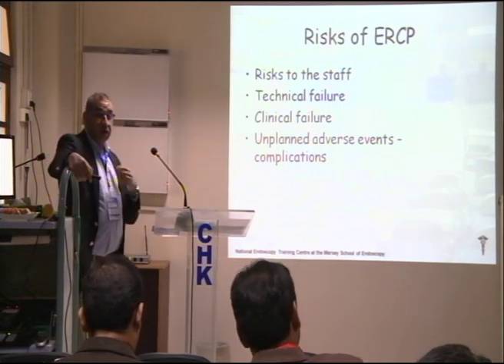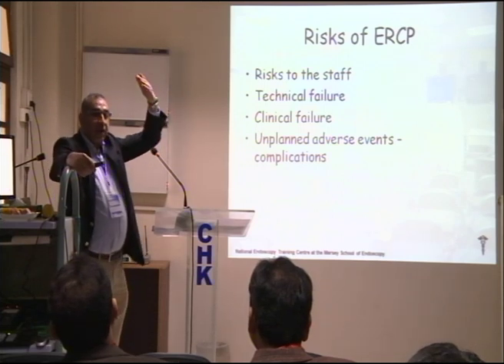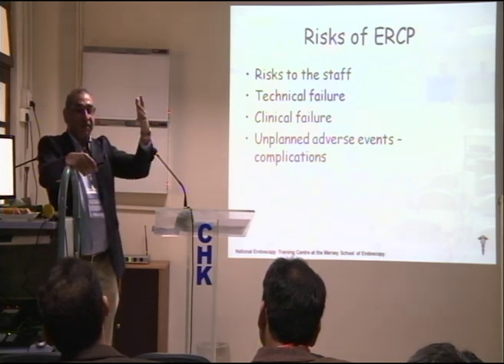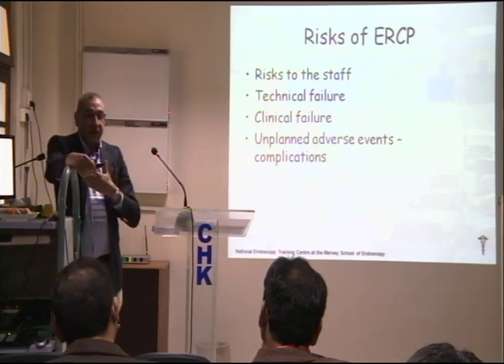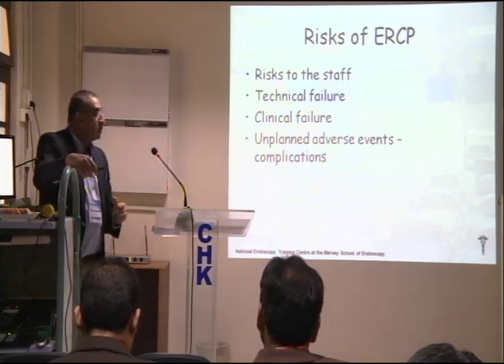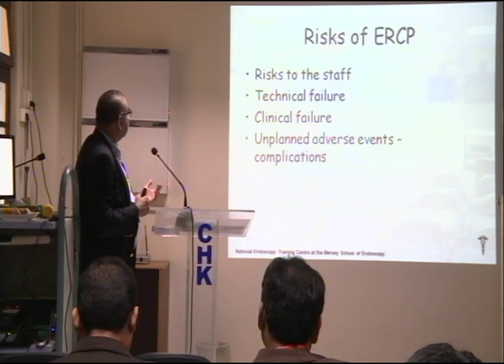Normally, we all wear dosimeters, we all have thyroid shields, but in our unit, I'm sure Khalid also has that, we've got lead glass between the fluoroscopy equipment and the patient and ourselves, and another lead curtain under it, so that exposure is minimized. And normally we don't allow pregnant staff members inside the ERCP suite.